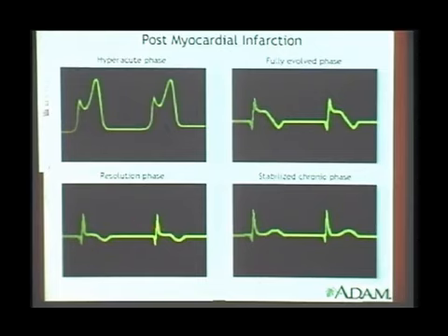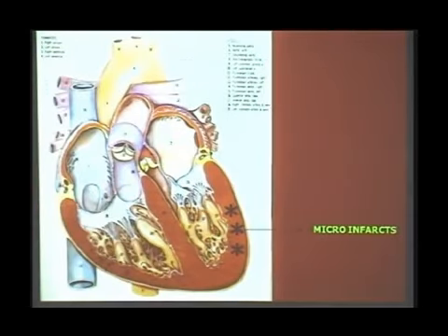So this is the resolution phase. And in the chronic stabilized phase, the Q wave, no injury or no ischemia. So this is the evolution of your ST elevation MI, of the ECG signs, and at each stage what you are supposed to do to make the patient better. Then I'll give you the recent concept of what is known as non-Q wave myocardial infarctions.